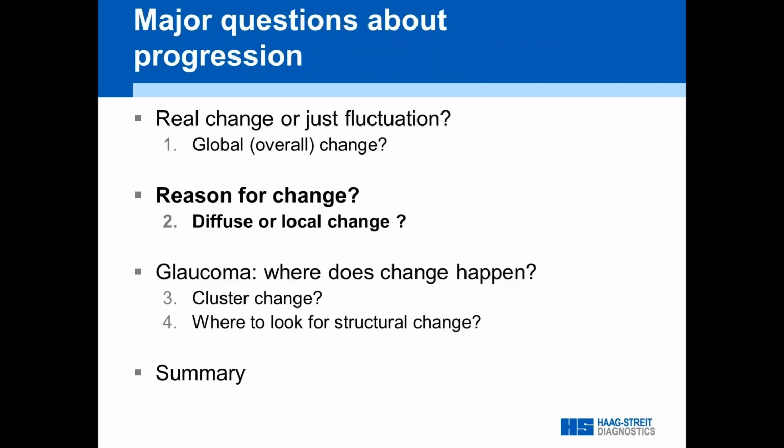Okay. I've got another question for you, if you can. The normal values for MD, SLV, do we go by the figures on the machine? So does it present the normal values for those? No, it doesn't. It doesn't look for normal values when it.